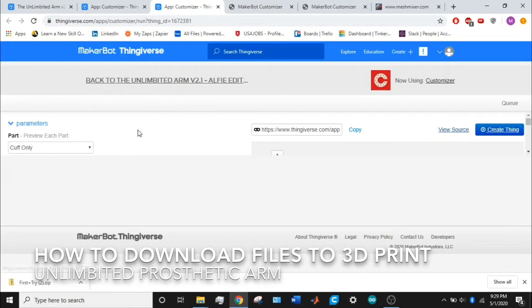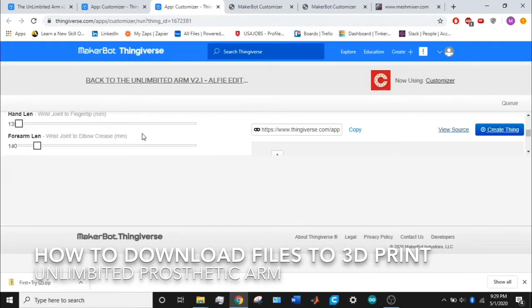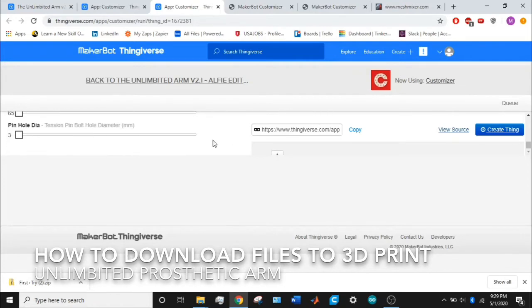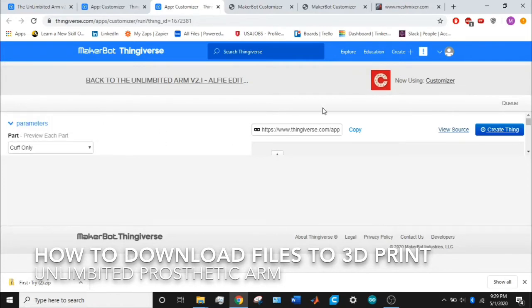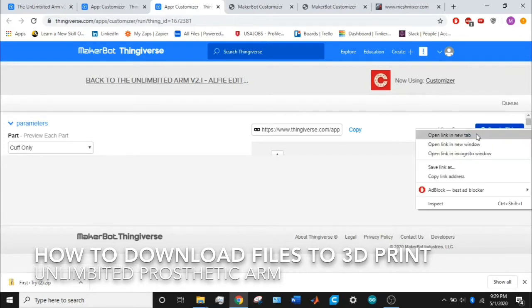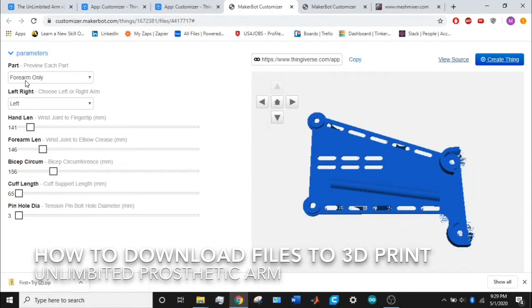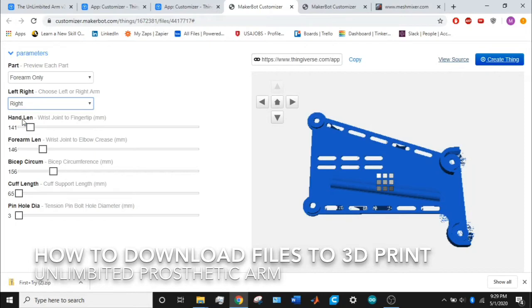Once you get to this page, you'll notice your screen looks like mine—it looks horrible and you really can't tell what part you're looking at other than the name. What I did was right-click, create thing, open a new tab, and it should take you to something like this where all of the parts are easily visible. This is the forearm part. You can choose left or right arm.